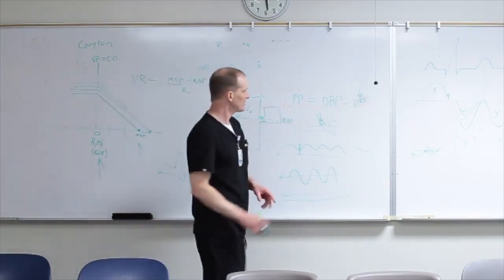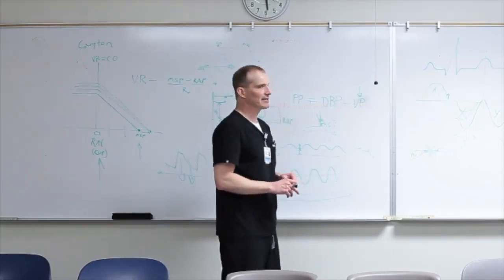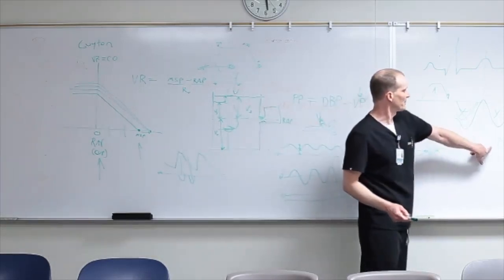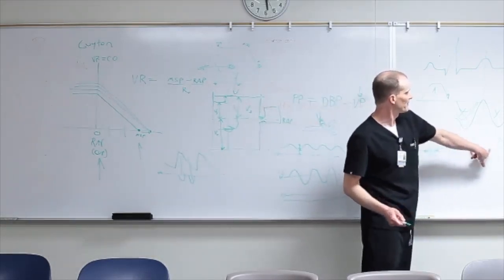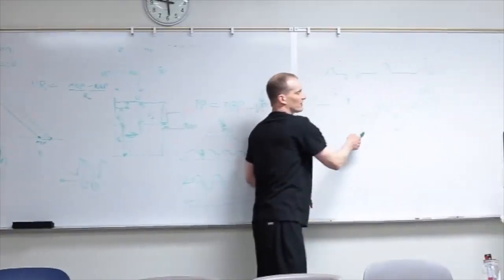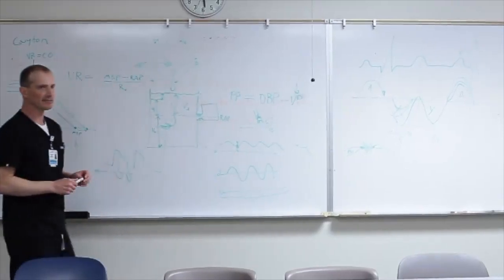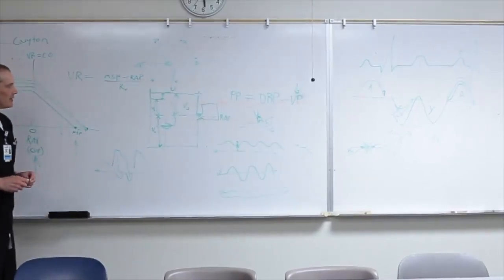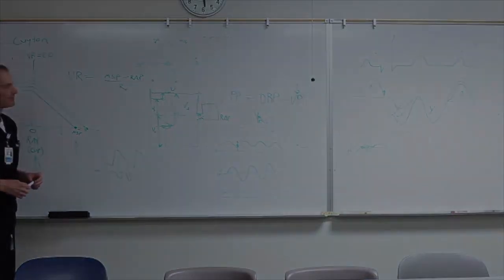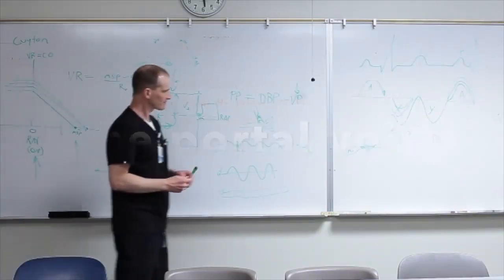The reason I do it is that you can calculate the right atrial pressures pretty accurately by taking the ratio of this to the sum of these two velocity time intervals, or actually peak velocities too, and plugging it into a formula, and you get right atrial pressure at the other end. But really all you care about is if it's high or low. Okay, so how do we do it?